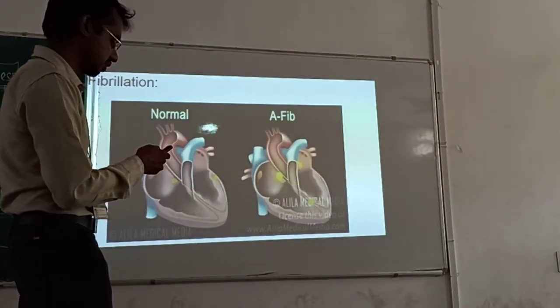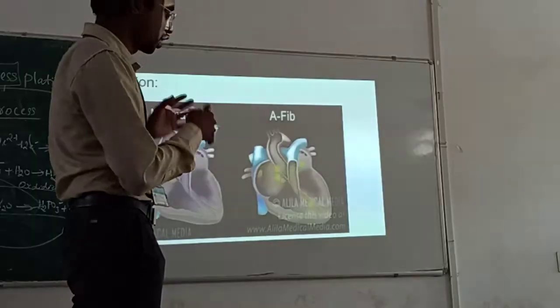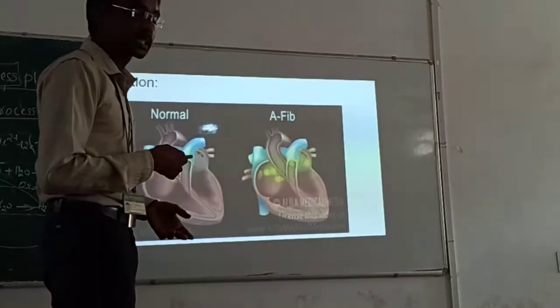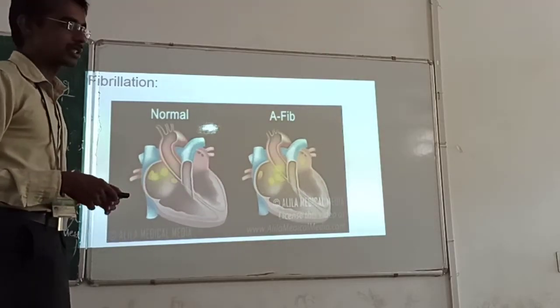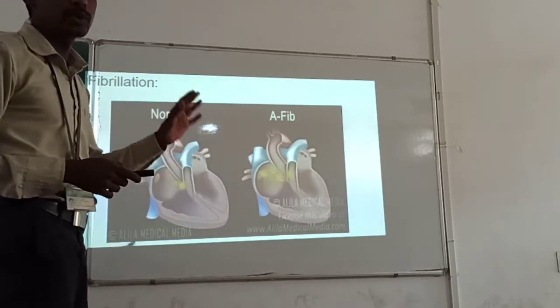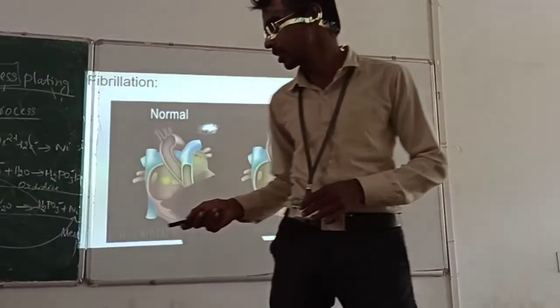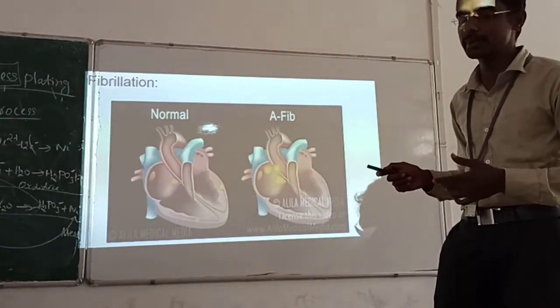To correct this, we need not do anything extra. If you just provide a shock to this heart, sometimes the heart activity might reset. It will not always result in success, but this is trying our best chances. It is like when there is a loose connection in some equipment, you give a shock by just beating it. Similarly, we do the same thing but through an electrical one. That is what defibrillation is.